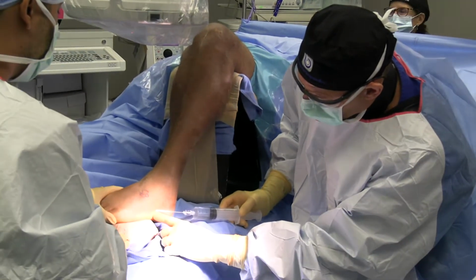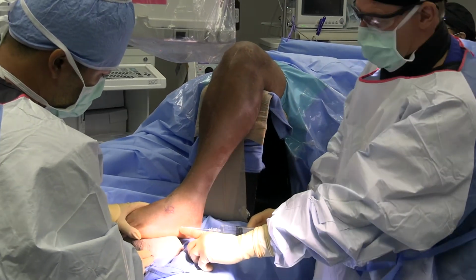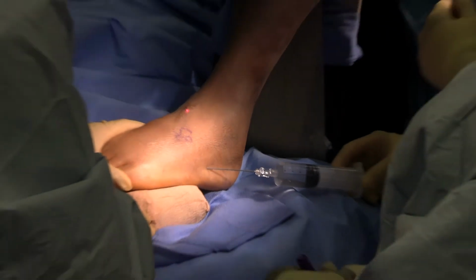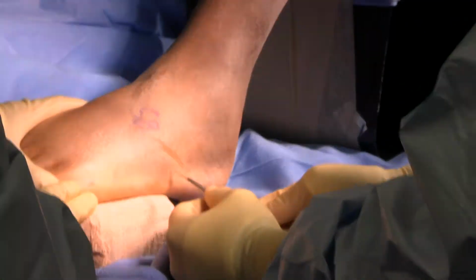The key to doing this surgery quickly is to see where the skin of the sole of the foot changes to the skin of the top of the foot. That's right at the level of the incision that we want to make. See how the needle's just right where I want to start? Start there, go right in. So this is my anesthetic. I'm just giving a little local. So we're just going to make a small nick in the skin.